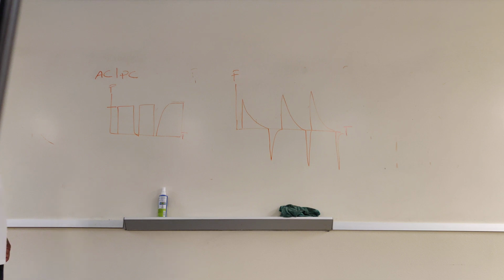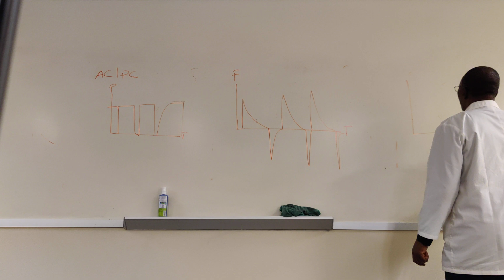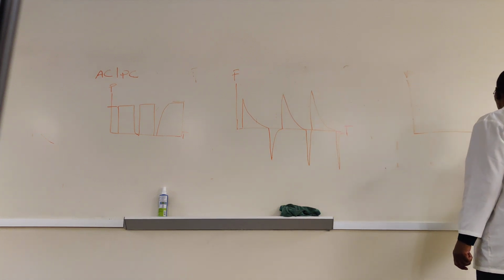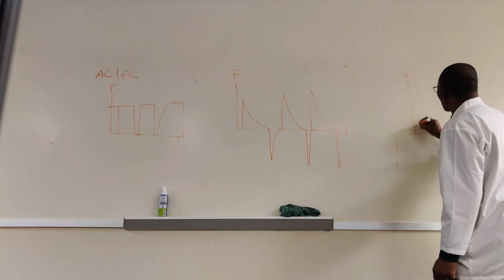Okay? And then volume time curve, well, that's a controlled mode. You're using the same I time. The tidal volume will be relatively constant unless there is a change in compliance or resistance. Okay? So it's like that.